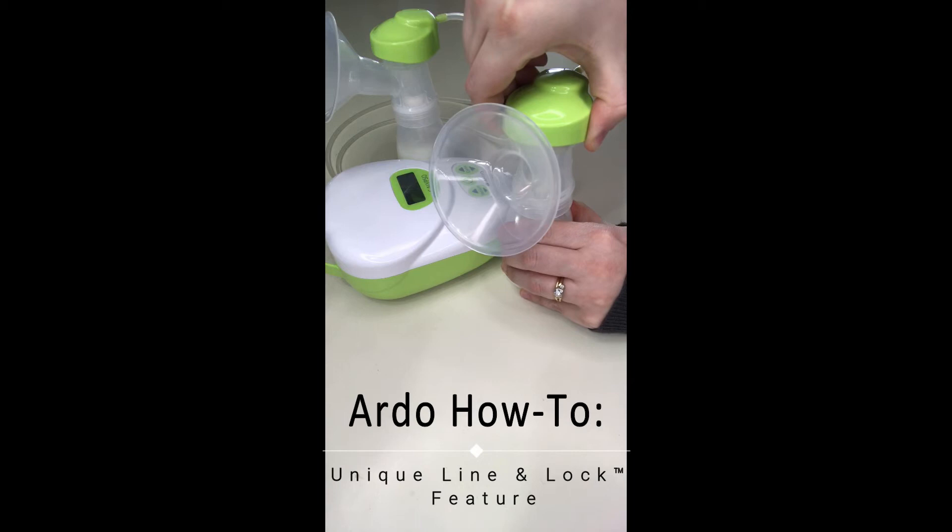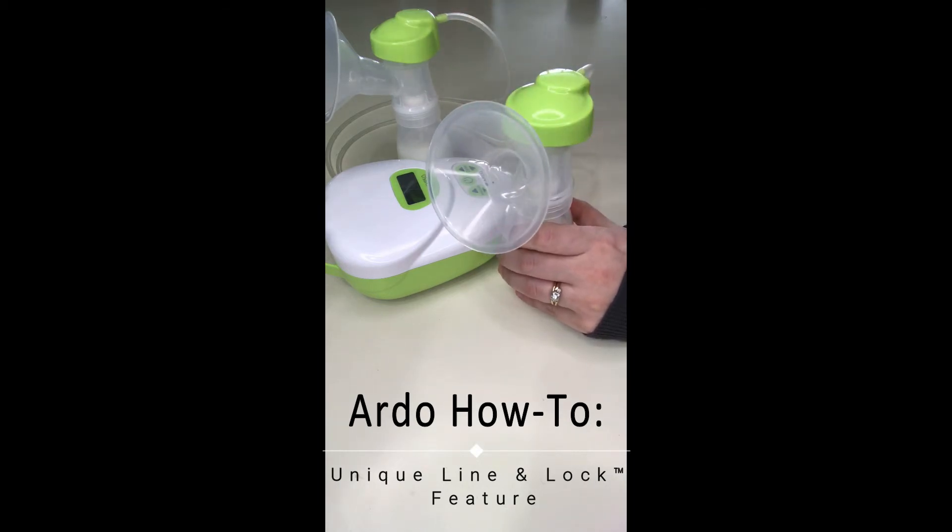When you do this you can ensure that there is a locked pump set and you don't have to worry about milk getting into your tubing or the pump itself.